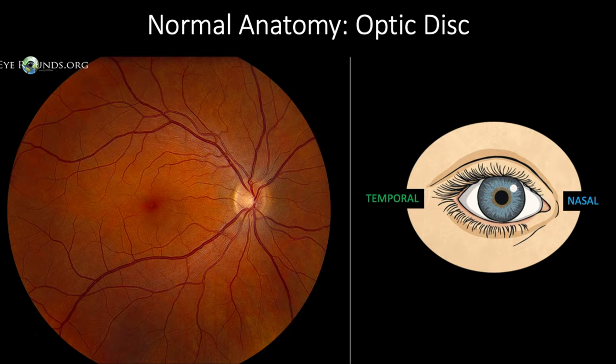First we're going to start off with the normal anatomy of the retina. On this slide we have a fundus photo of a normal retina. When describing the fundus there are four areas you want to examine closely: the disc, the vessels, the macula, and the periphery.